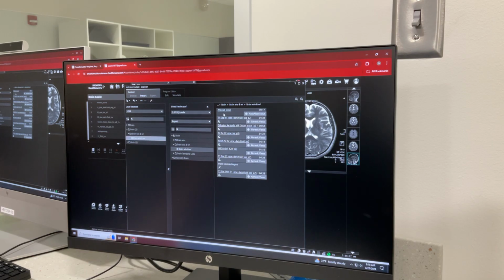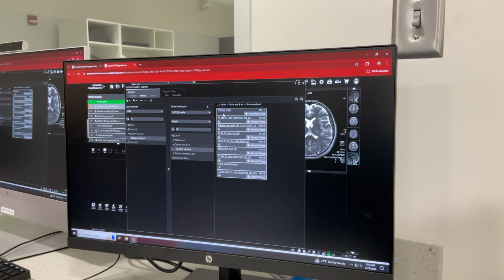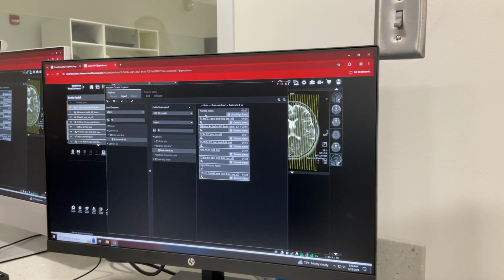All right, so if you click on your scout, hold down your shift key and click here. Okay, now let up, you can drag the whole thing over. And I don't know if it's just being really slow right now. There it goes. All right, did you get yours pulled over? Yes.